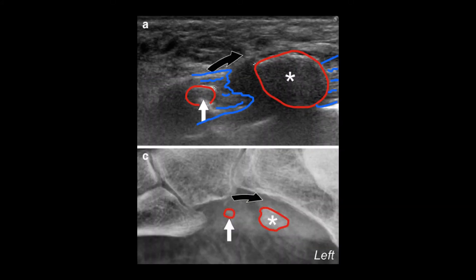This axial image shows a couple of things. First, you can see the os peroneum, which is asterisked on the right side of the image in the larger red circle. Then you see an avulsion fracture, which is the smaller red circle on the left side of the image.